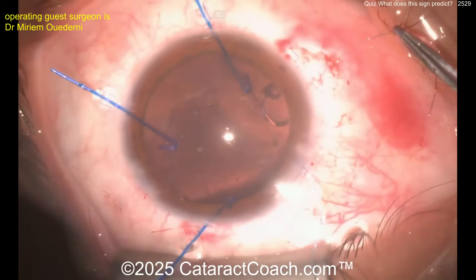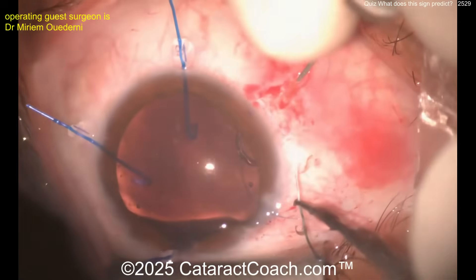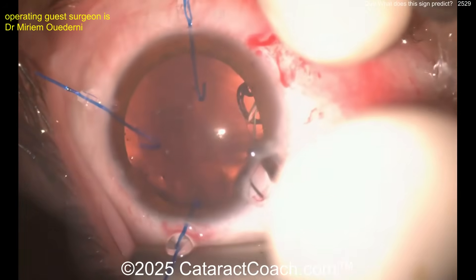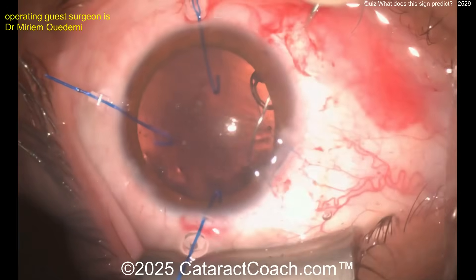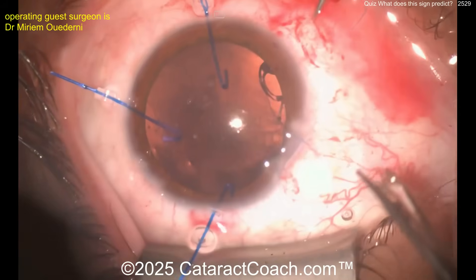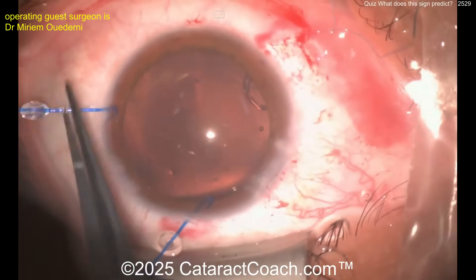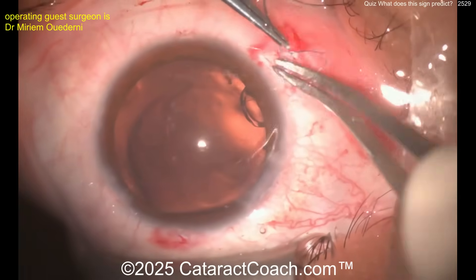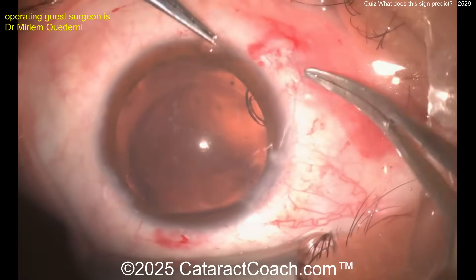On the other side you're going to put a capsular tension segment, so you want to get support 180 degrees away — this one point may not be enough. Here's the other end of the suture going in the hollow bore needle again. Now you've got both ends holding onto that eyelet of the Cionni ring, coming out in the sclera within that groove. That half scleral-depth groove — tie this up, make sure it's a nice secure knot, and that'll be good strong fixation on this side.